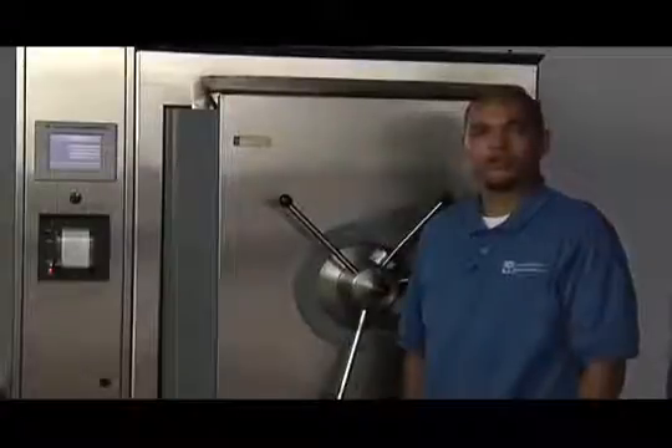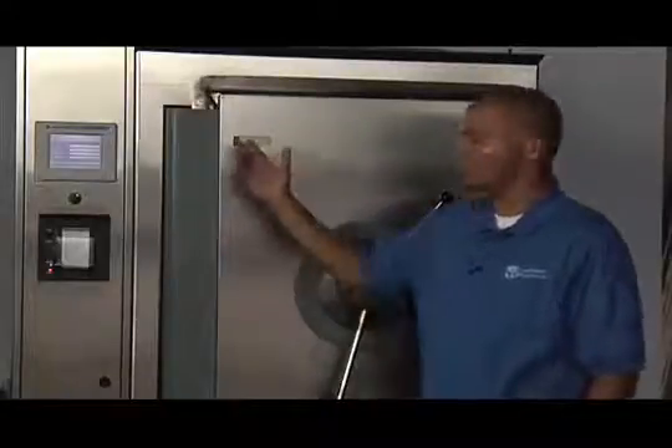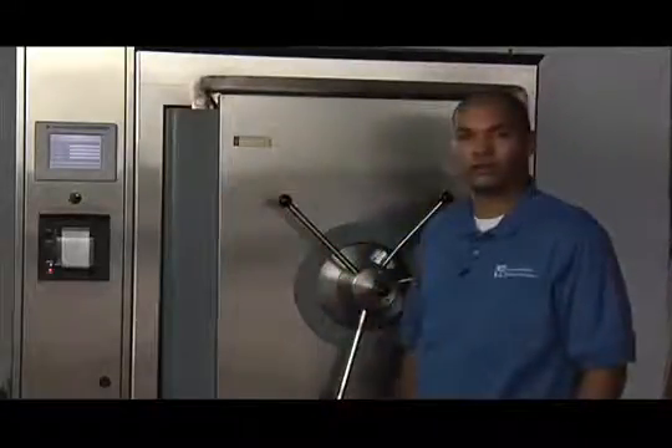At the completion of the cycle you must allow enough time for the pressure inside of the vessel to dissipate. It is important that the reading on the controller as well as gauges on the front of the unit both have a reading of 0 PSI before attempting to open the door.